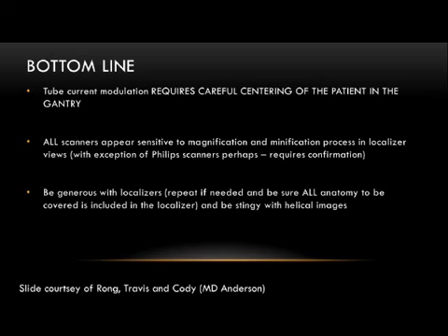You go with the liver? Okay. All right. We got one vote for the liver. I think that makes a lot of sense, especially since I think we have seen that the changes through the thorax, especially the angular tube current modulation, might not be changing as much. So maybe that also plays into making sense to use it for the liver.